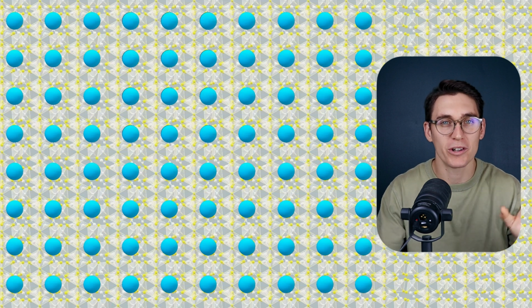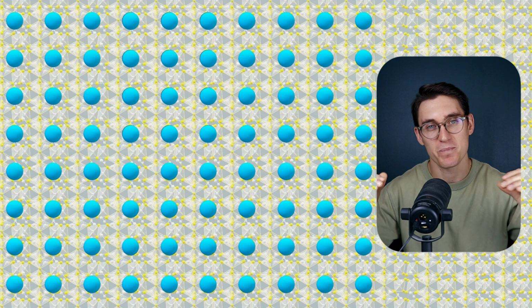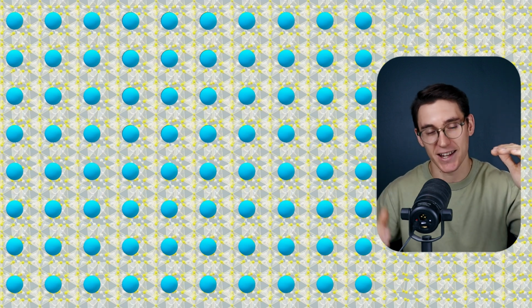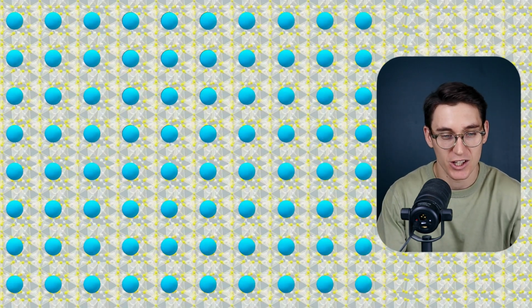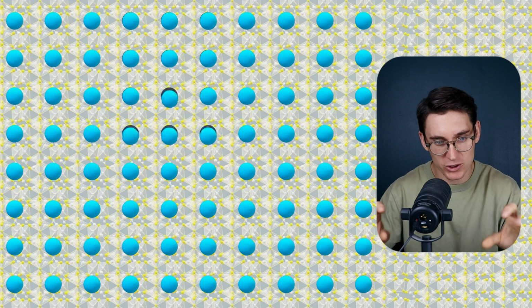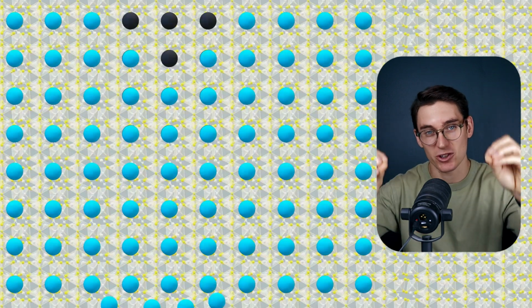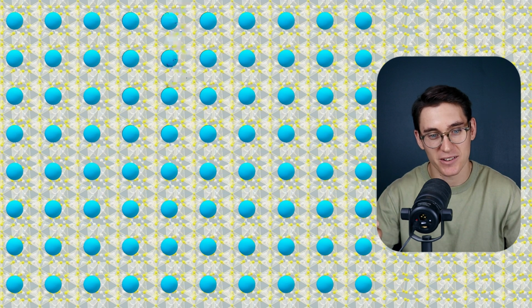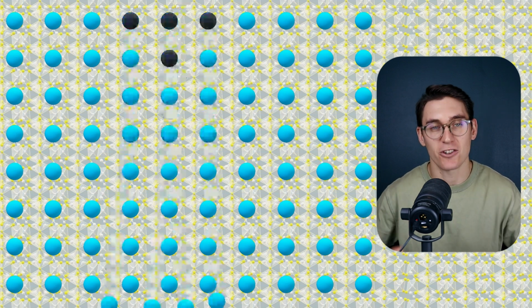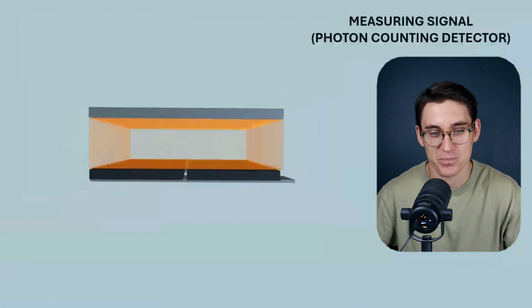Let's look at that more in real time. You'll see that the interactions often happen closer to the cathode. Electron holes move slower than electrons move, and that's why the cathode is on the patient side of our detector and the anode is on the computer side of our detector. So watch how this happens. Photoelectric effect or Compton scatter, the hole looks like it's moving towards the cathode and the electrons actually do move towards the anode. You can watch that again. X-ray coming in, electron cloud being released, and holes moving towards the cathode. That's the foundation for photon counting CT.